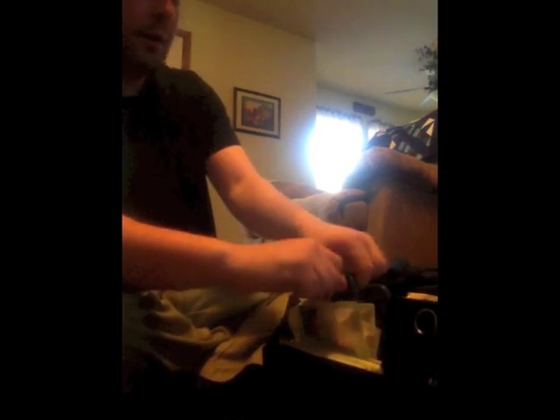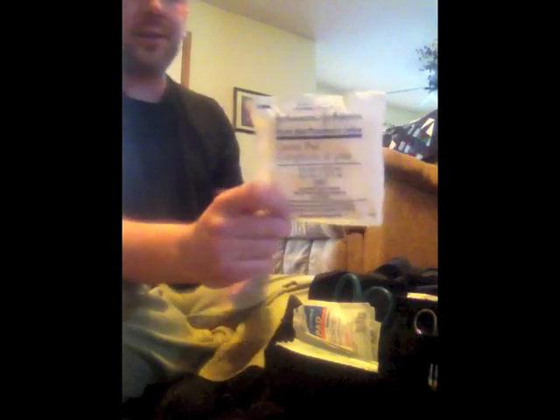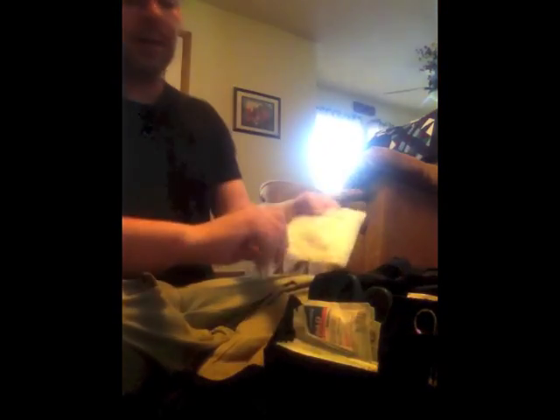Some other things I carry are trauma shears, and this is good for cutting clothes. Also bandages. I used to work at the hospital, and these were great for cutting bandages as well. Or not bandages, bracelets, stuff like that. Then we come over here, we have some dressings. These are going to be my 4x4s, and I have a whole bunch of these. And these you can just get at CVS or Walgreens, a drugstore like that.